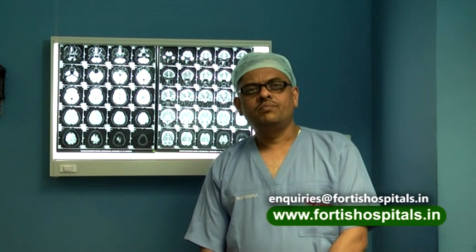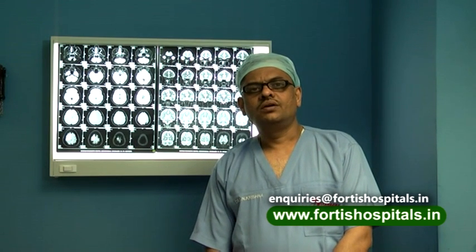By doing that, we can avoid damage to these vital structures. That is what we call awake craniotomy, and by doing so we can preserve vital brain structures. Today we will be taking you through the procedure itself. Let us see how we do it.